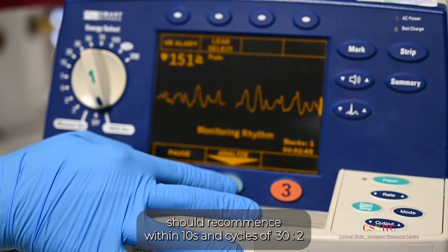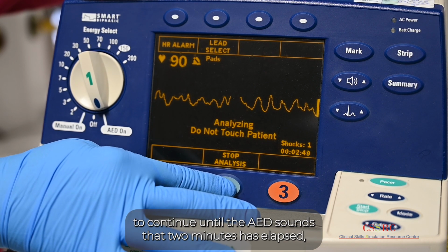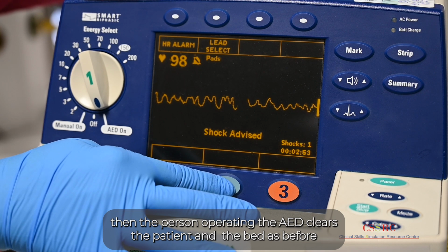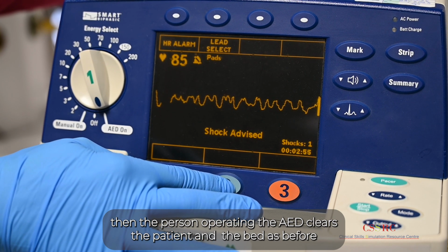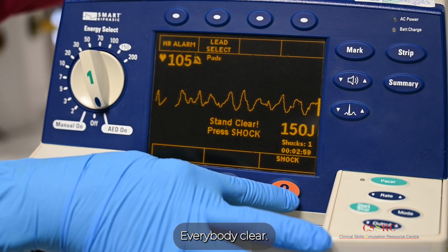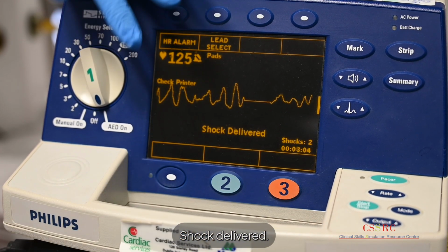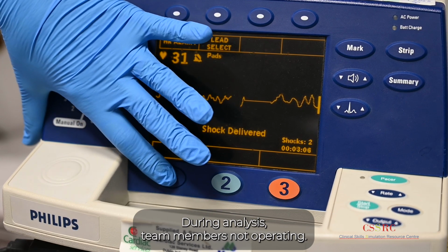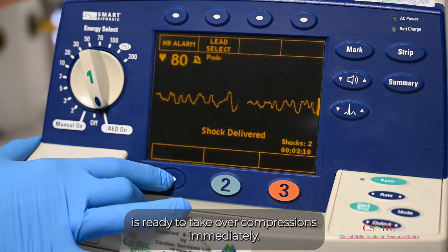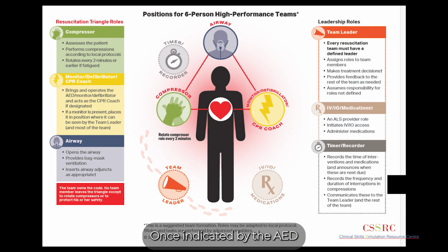Compressions should recommence within 10 seconds and cycles of 30 to 2 continue until the AED sounds that 2 minutes has elapsed. Then the person operating the AED clears the patient and the bed as before and presses 2 on the AED for analysis. Everybody clear, stay clear. Shock delivered. During analysis, team members not operating the AED should swap roles so that a different rescuer is ready to take over compressions immediately once indicated by the AED.